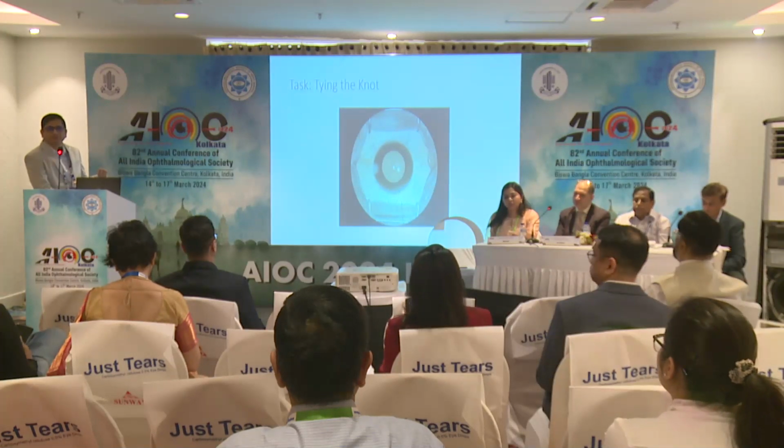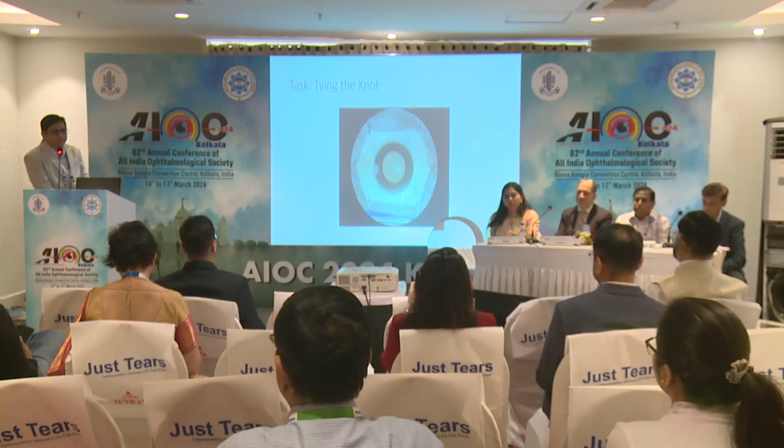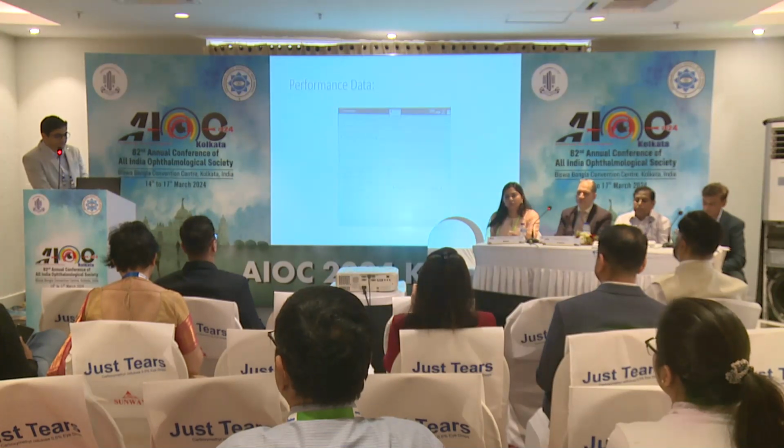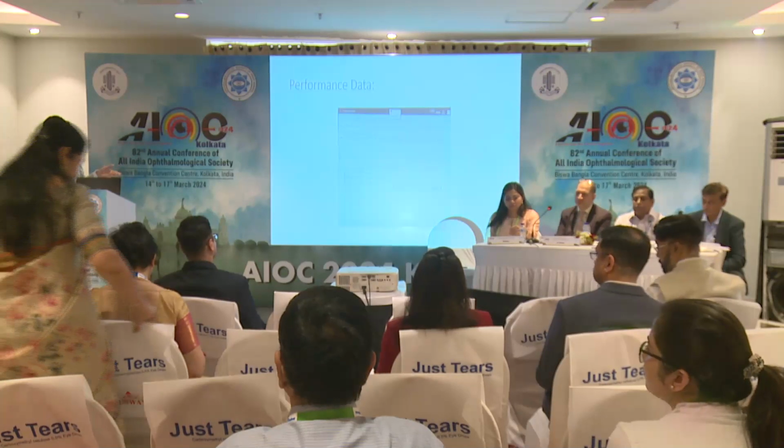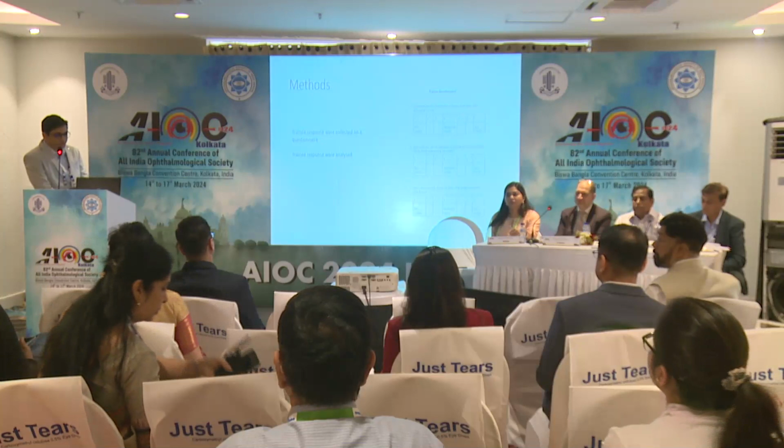And the next step that was taught also consisted of making the knots, which involved doing the throws that we do, whether you're doing forward, reverse forward, 3-1 or 3-1-1. Those steps were done on the simulator, and then the trainees were given a questionnaire that was filled, which was also objectively assessed. There is an objective assessment on the simulators which tell us the exact depth, the distance where it was passed, and the throws that the trainee did while suturing.